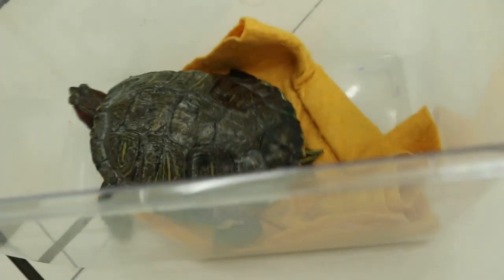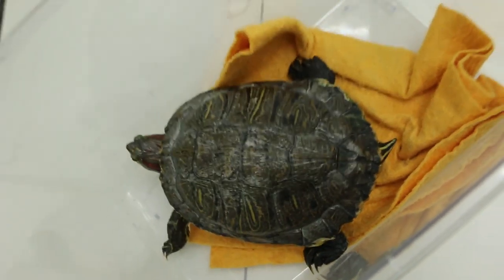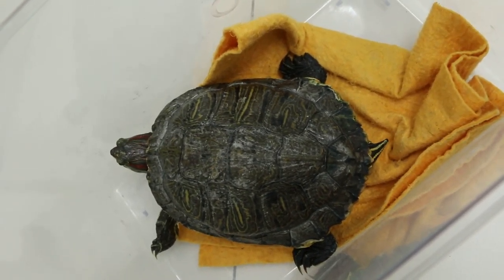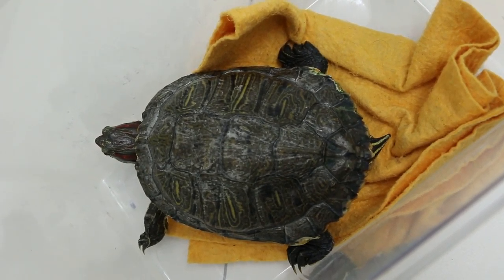So now we have to prepare the tortoise. It should be a dorsoventral view. What happened: three days ago there was an egg stuck in the cloaca. So Dr. Daniel punctured the egg.